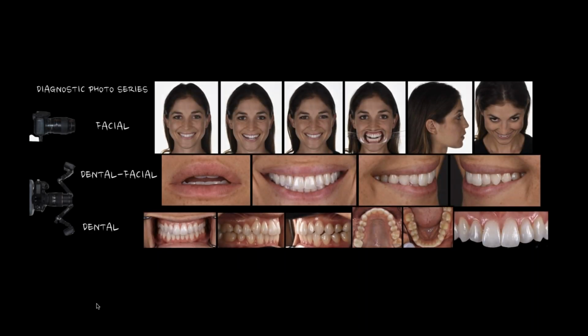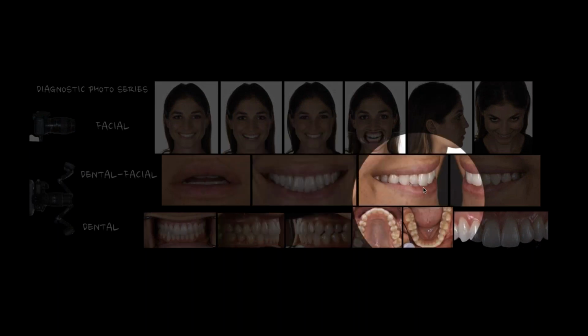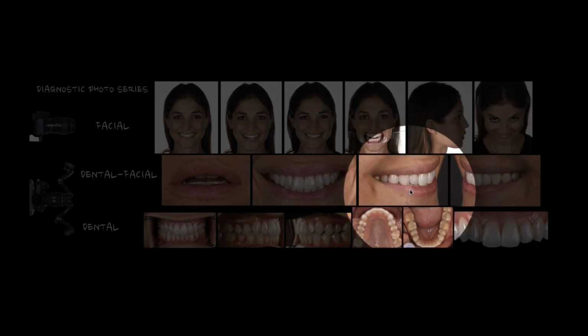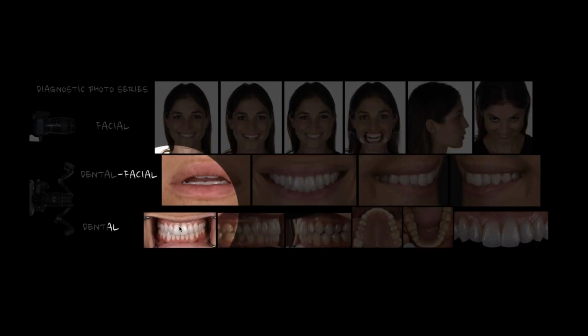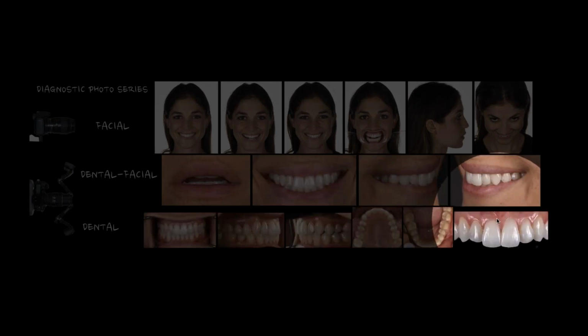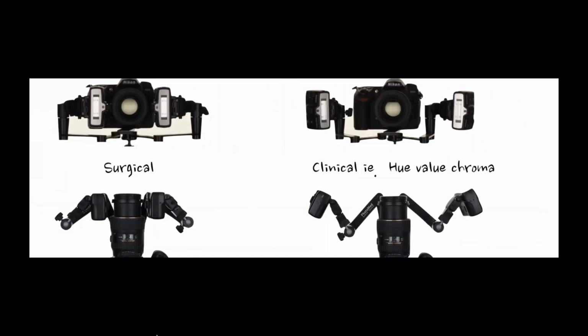And that's going to be my repose photograph, my close-up photograph, lips and teeth, left and right lateral shots where my focus is primarily on the lateral tooth. And then I come back and retract, and my retracted close, left, right, occlusals, and black background. And that is my standard sequence of photographs for basic diagnostic information.